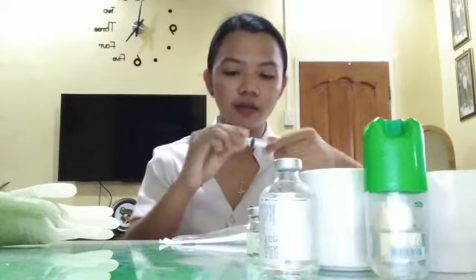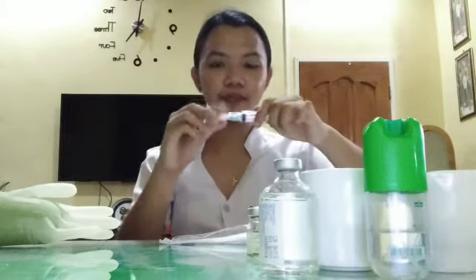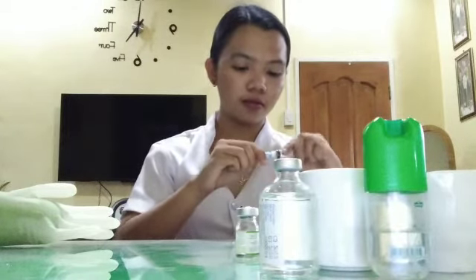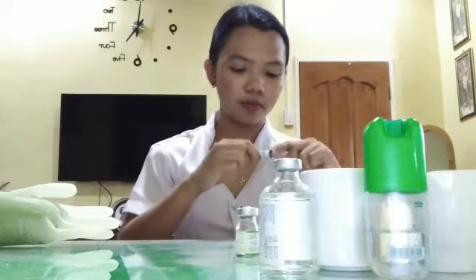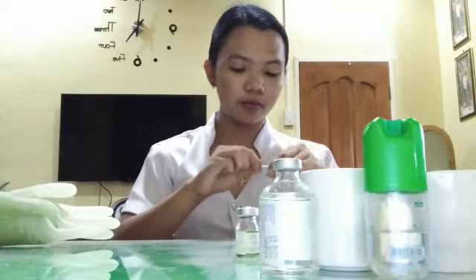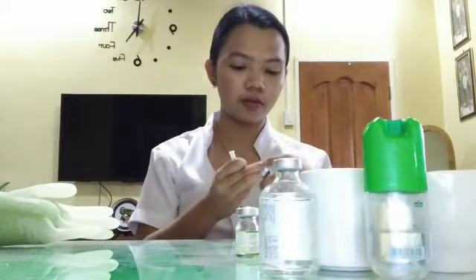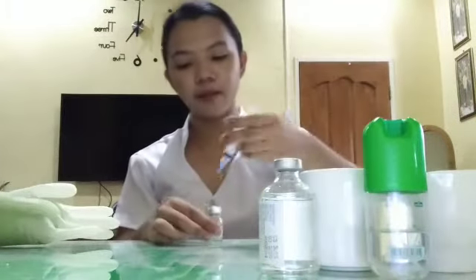Okay, so here it is. So next thing to do is we will withdraw the prescribed amount.